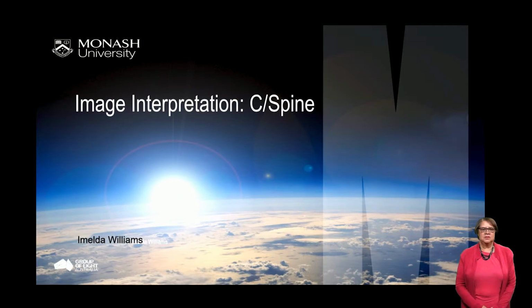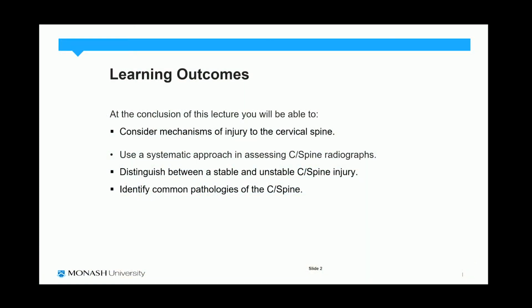This presentation will focus on image interpretation of the spine, with a main focus on the traumatic conditions of the cervical spine. I hope that at the conclusion of this lecture, you will be able to consider the mechanisms of injury that affect the cervical spine.